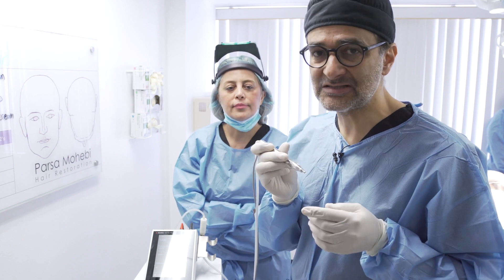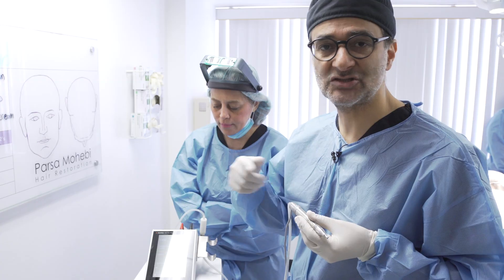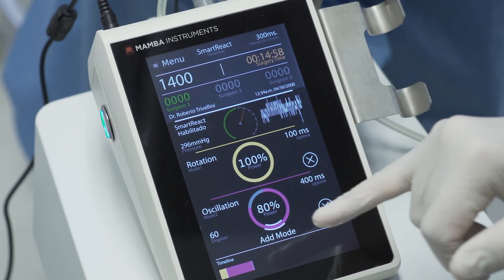That's the delay time that the Smart React has to wait until it works. So basically when you touch the skin, it gives you 300 milliseconds — as you can see here — until the system gets started with phases of rotation and oscillation.